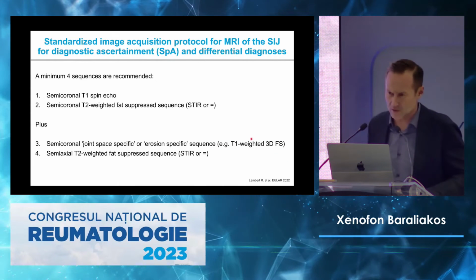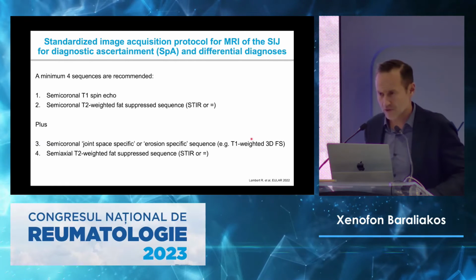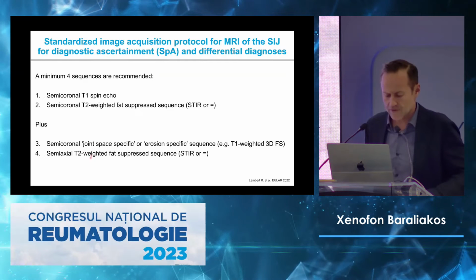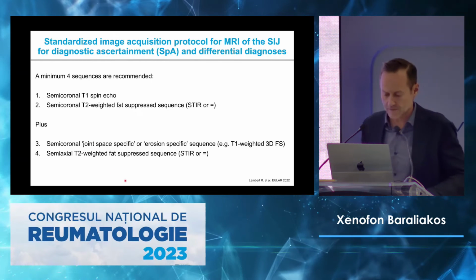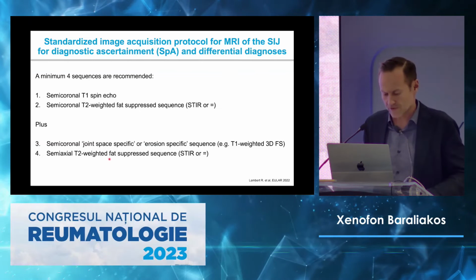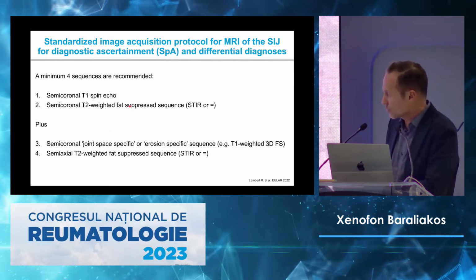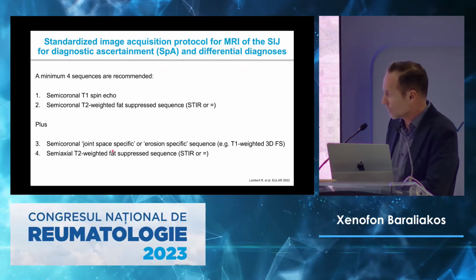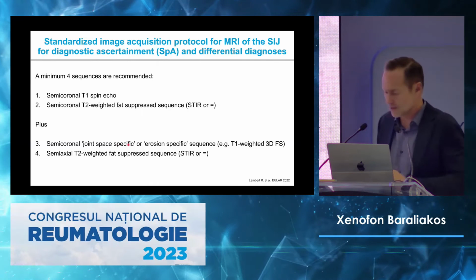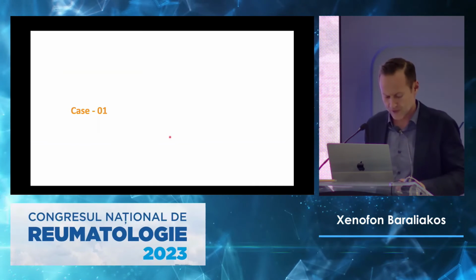I didn't show this now. You may have heard the VIBE technique. If you haven't heard that, forget it again. We'll discuss it another time. And a semi-axial STIR sequence in order to see the inflammation as well. So it is, in fact, this typical protocol we would request. I've shown you those 3, that one, and that one: semicoronal, semi-axial, and the VIBE technique or the erosion-specific technique is something that we can discuss another time.